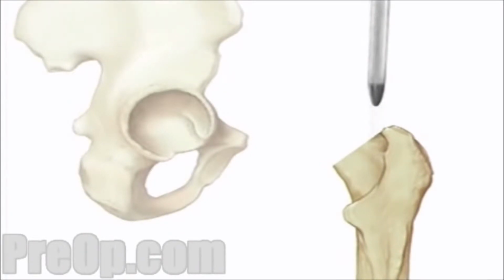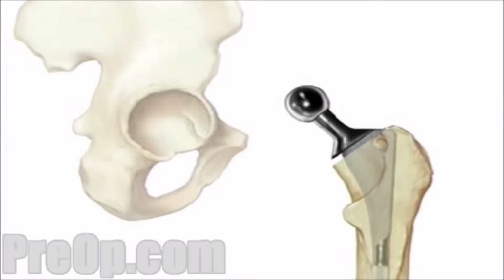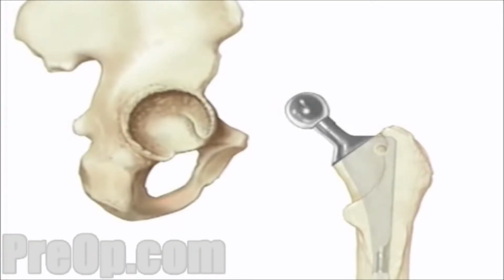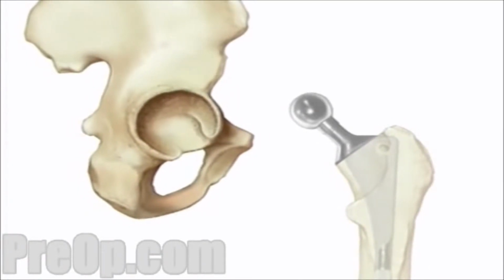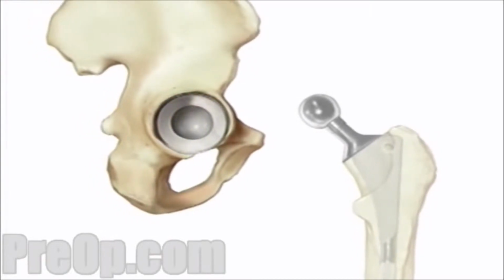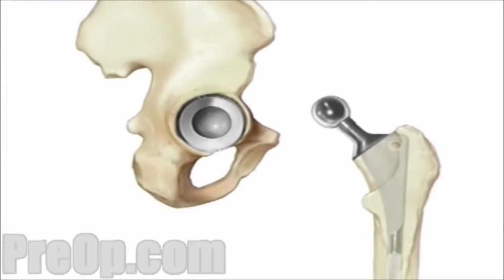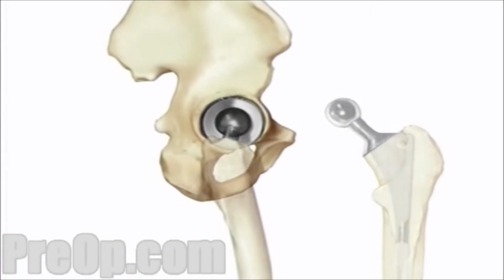A specially fitted artificial ball joint slides into the top of the thigh bone. Next, your doctor will smooth the inner surface of the hip socket. Once the hip socket has been thoroughly cleaned, the artificial lining will be secured and placed with special screws. The artificial ball joint is turned inward and fit into the socket.